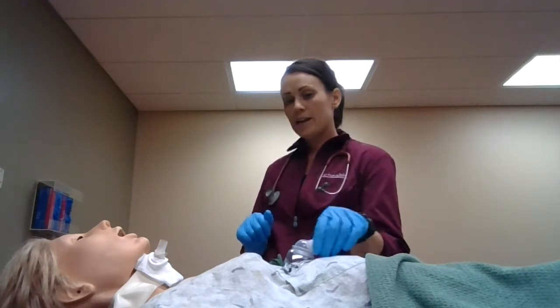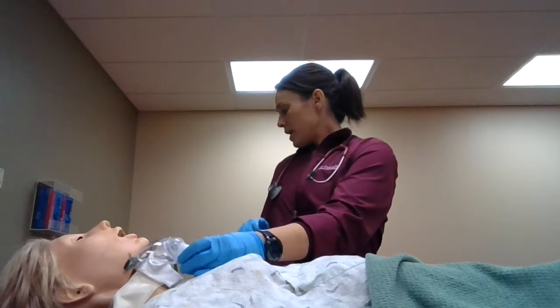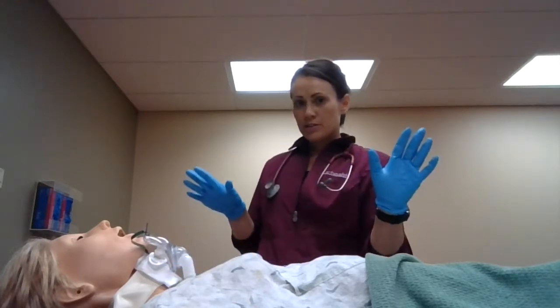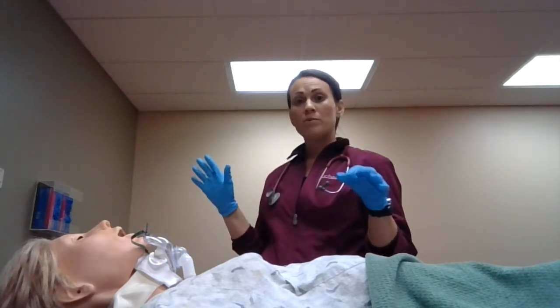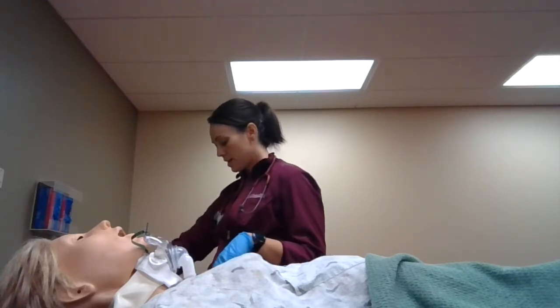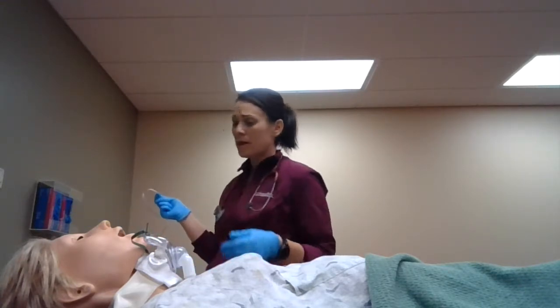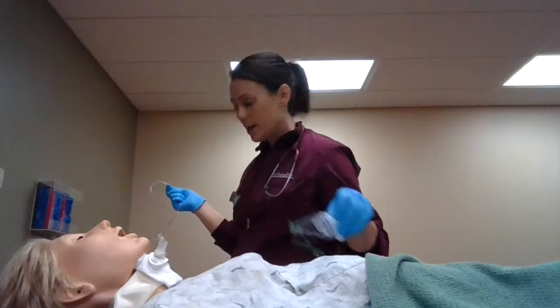I'll get my trach mask so I can hyperoxygenate the patient and go ahead and get that suction kit. We'll go ahead and hyperoxygenate Mrs. Smith. While we're doing that, using sterile technique, I'll put on my second set of gloves. My left hand will be my clean hand, my right hand will be my sterile hand. I'll put the lube on my right hand and hold my suction catheter, then hook it up to the wall mount.